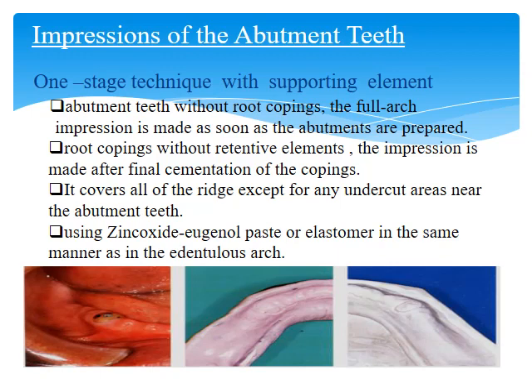Impressions for the abutment teeth. One stage technique with supported element. The abutment teeth without root coping. The full arch impression is made as soon as the abutments are prepared.